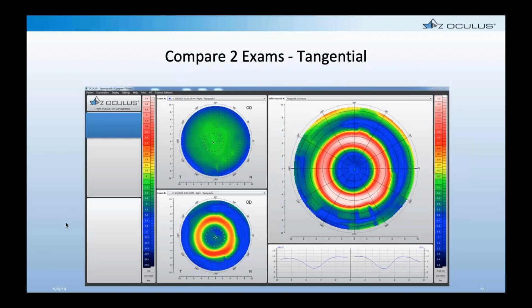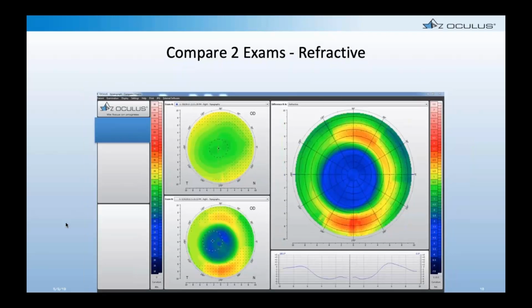So here is that comparative map with the refractive. And what I love about this is, for our patients who are doing Ortho-K, we typically have the patient come back from the waiting room, and the very first thing we do is corneal topography. And so I'll have a student or a technician go do the corneal topography. They'll take the patient to the room, check their acuity, refract them if necessary, take a look with a slit lamp, and then come get me to come evaluate that patient.